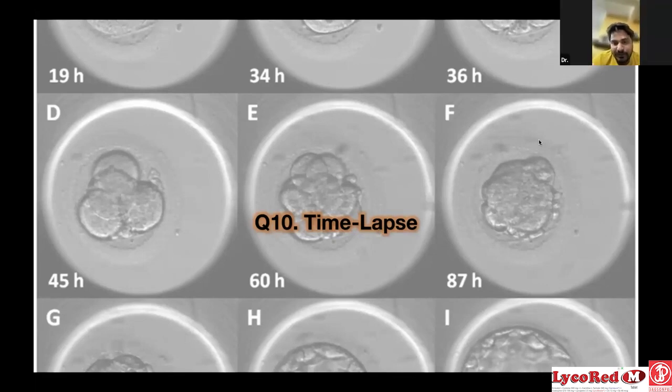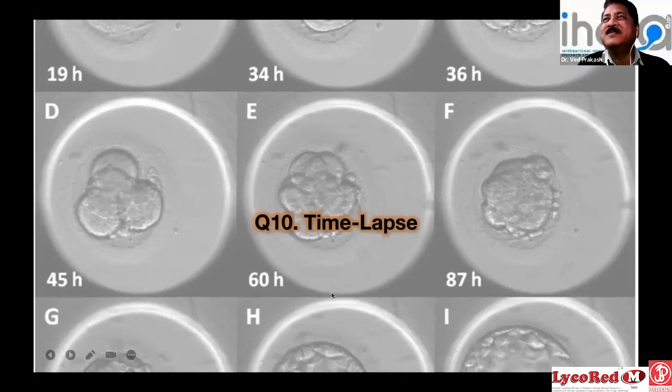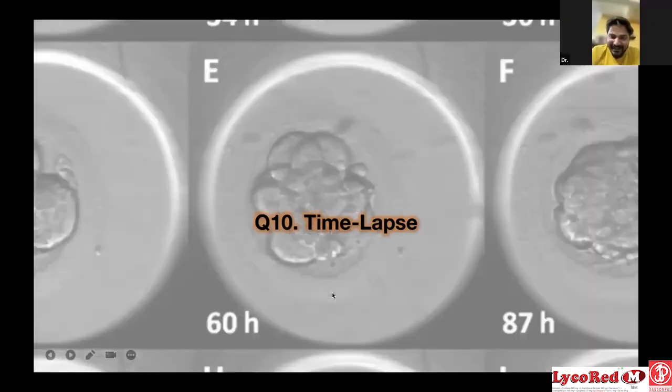not for routine use. And see, recently in one of the closed meetings I met Ramaraju sir from ISAC. He was saying he's using time lapse for all the cases in his lab, and he said he's going to produce a paper on that. Maybe we have to wait for the paper. We'll see how it is improving the success rates. So he is using Geri. Definitely, it's a marketing tool again for the patient as well.